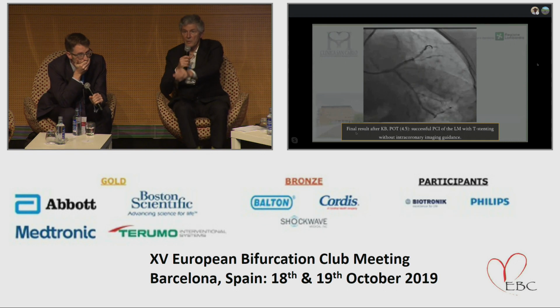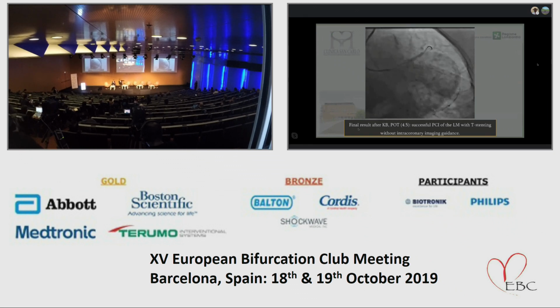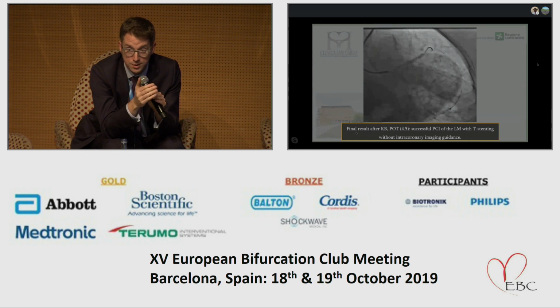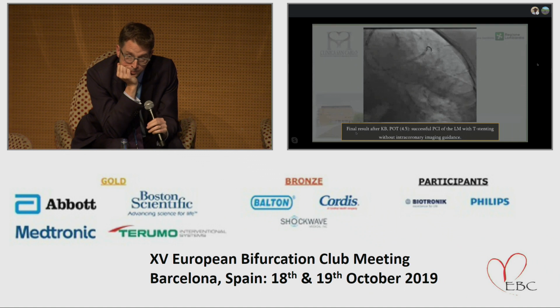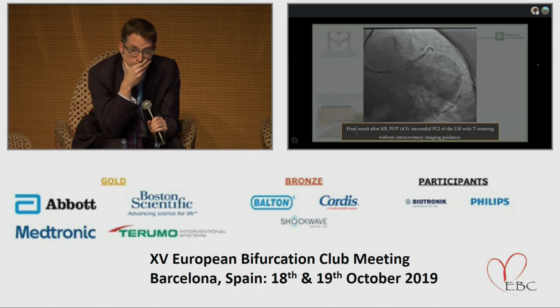So the stent is a self-expandable stent. I'm not sure what imaging was done the first time. It would go to a certain diameter and it would stay there. You can't punch it unless you put a balloon expandable stent afterwards and stretch it. The 3.5 will go to 7 millimeters in principle, but the crossing through the side of the device and ballooning will result in disconnection of the linkers. Yes, but then there's another issue with the disconnection because, again, it's a nitinol stent. It doesn't necessarily flap over unless you put something that keeps it up there, scaffolds it.